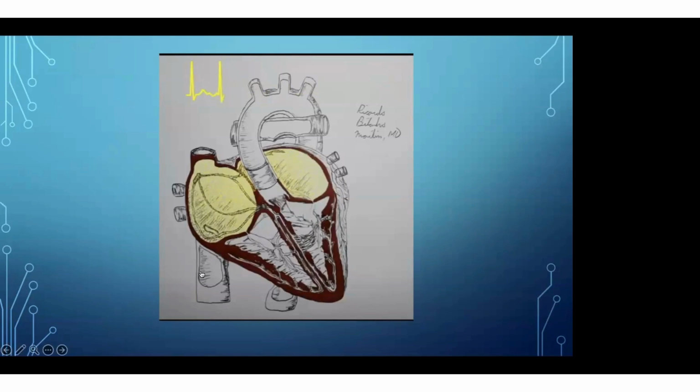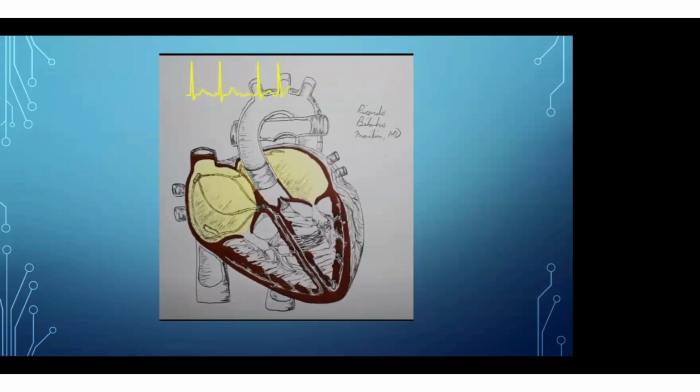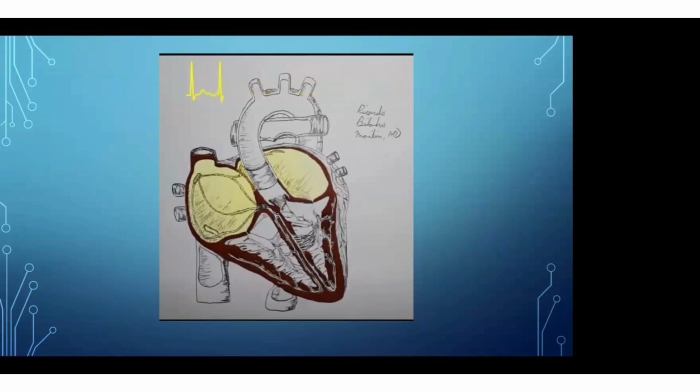If it conducts, we will see a patient with atrial fibrillation with a very fast ventricular rate. The patient will be in pulmonary edema if he has LV dysfunction or diastolic dysfunction, or the patient will be in shock sometimes, if the ventricle has diastolic dysfunction or is severely dysfunctional. So atrial flutter and atrial fibrillation can decompensate the patient if the heart rate is very high. The ventricular conduction is very high.